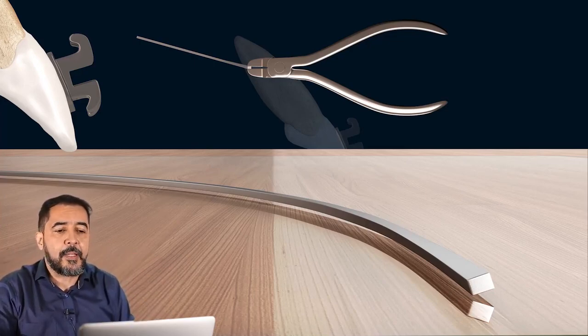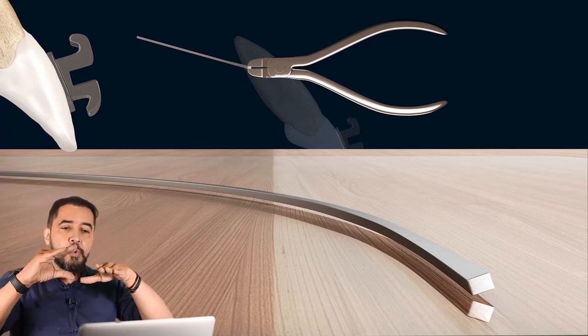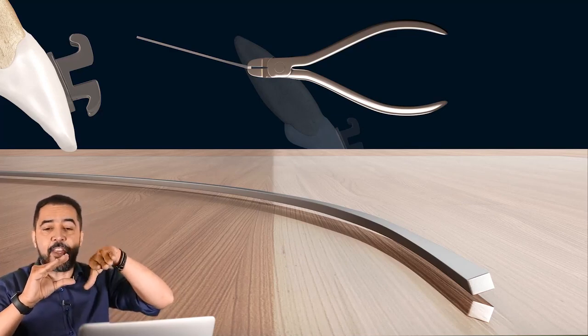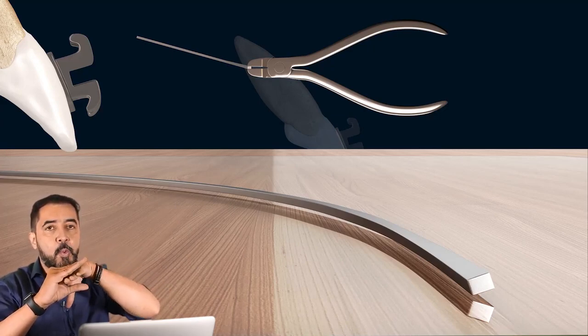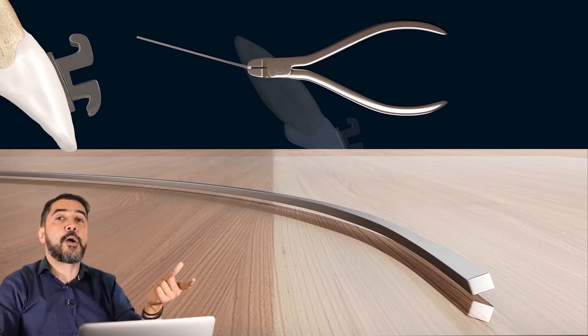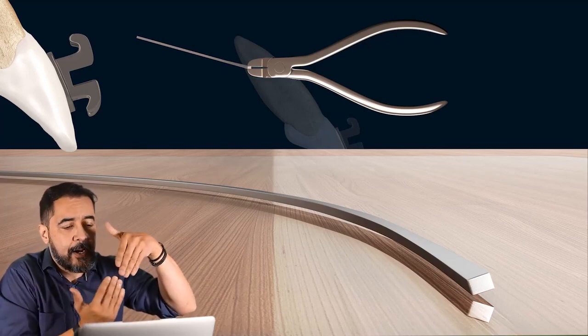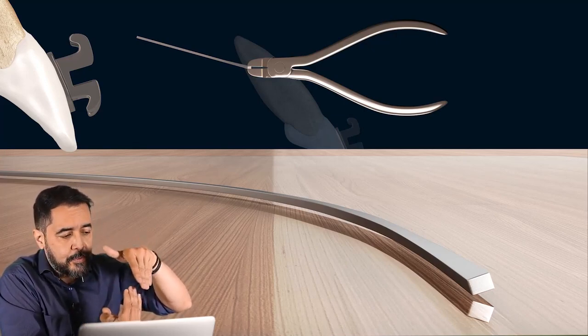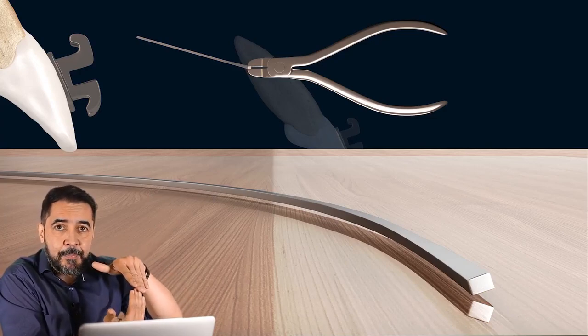You will generate a very good situation, because you will do the best thing for the case, making the inclination of the arch wire equal to the inclination of the slot, because you don't want to change that. At this moment everything was okay, and you don't want to change that incisor relationship. We want to keep that.